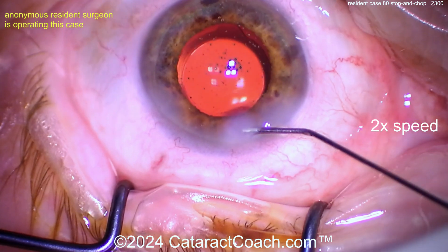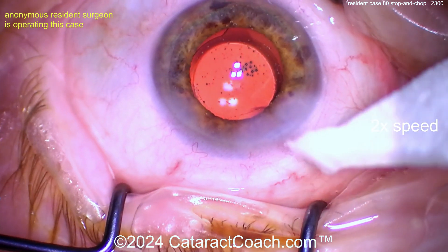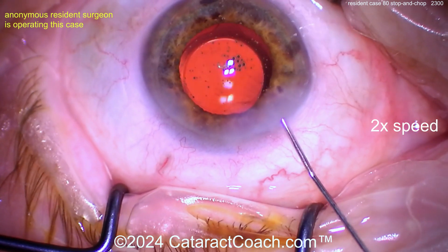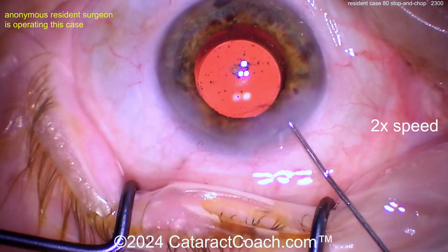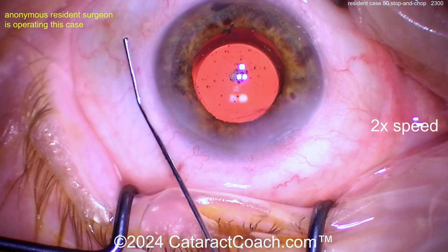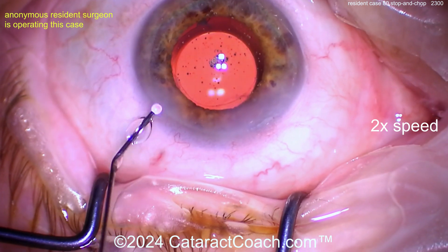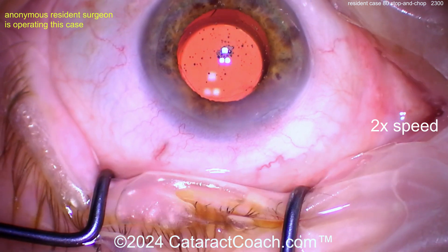There's a little leak from the incision. As a resident who's only done 80 cases, just put a suture in — you need to know how to suture anyway. You could hydrate more, but if it still leaks, the better part of judgment is to suture. That's still leaky to me. If a little hydration doesn't seal it, it probably needs a suture. Give the endothelial pump function about 30 seconds to kick in and start pulling down the roof of the incision to seal it.